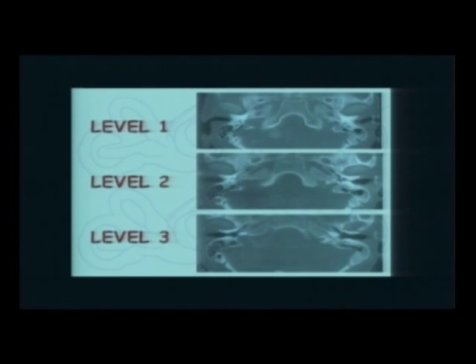And then we have what we call an apical turn, which is 3/4 of a turn. And the apical turn of the cochlea is not dome-shaped from above. No, it has a flat surface. It is like this ceiling that we have in this room. And this is one of the signs that this cochlea is fully developed, that it has a flat top from the top. It is not dome-shaped. If it's dome-shaped like that, this is an indication that this is an underdeveloped cochlea.